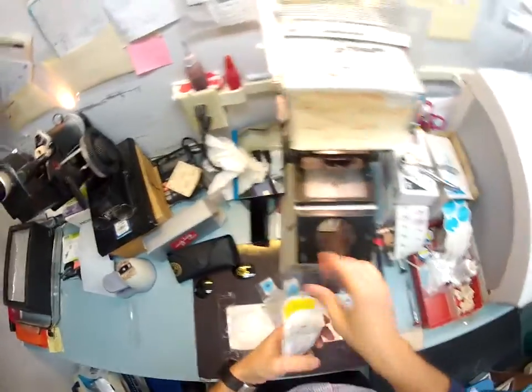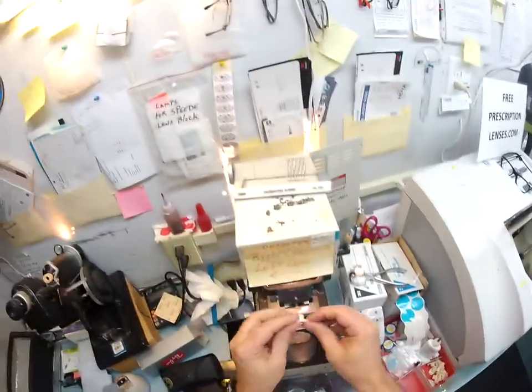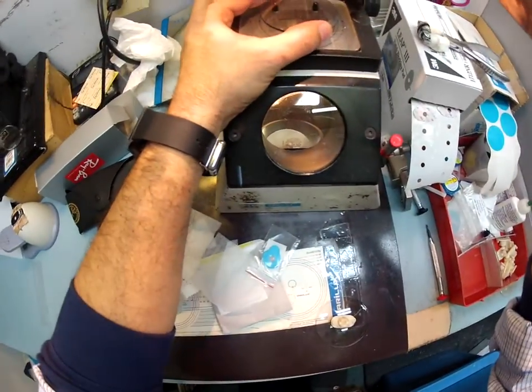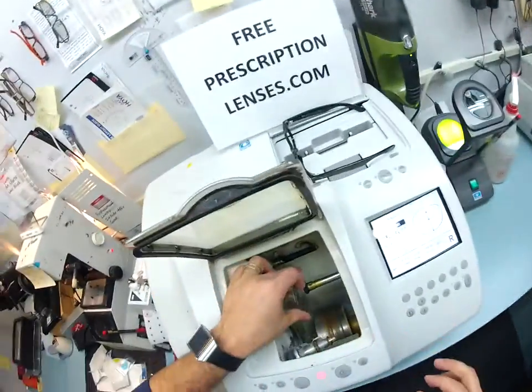Of course, I dropped that on the floor. Let me clean up after myself. Here's your left lens — put that in the blocker, pull off that sticker and get everything lined up in the center, put that block on. So now into the chuck it goes.